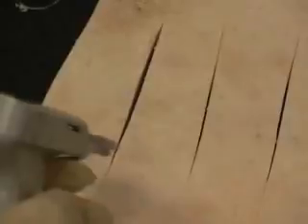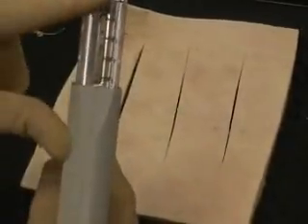There are different ones. Sometimes they have a rotating head, but essentially once the person is holding and everting, you're going to line up the little arrow with the wound, and you're just going to simply, and again, the pig does not staple quite as well as human skin does, just press down, squeeze, and you get the idea of how that might look. And this is about the distance that you would utilize.